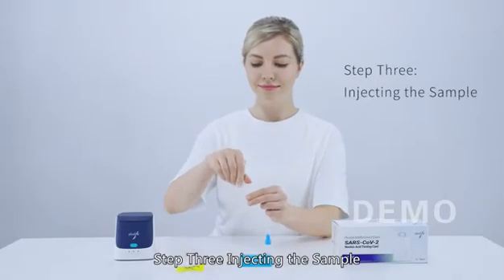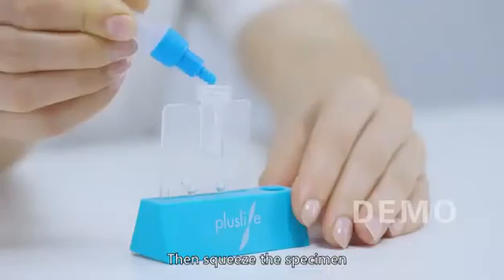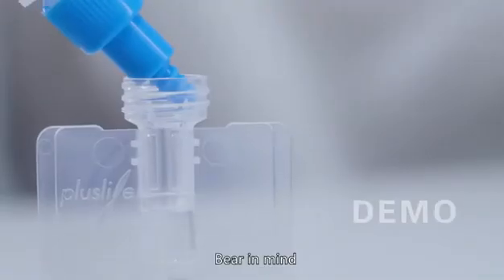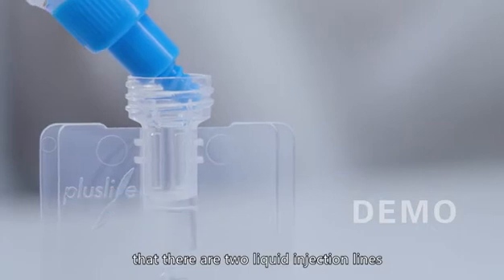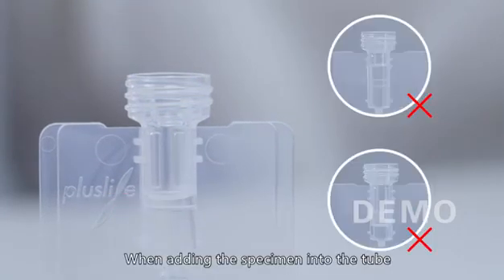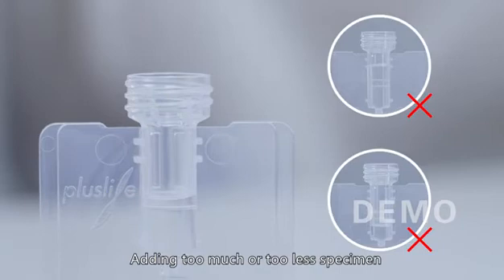Step 3 - Injecting the Sample: Unscrew the cap above the reaction card, then squeeze the specimen into the sample tube of the card. Bear in mind that there are two liquid injection lines marked on the sample tube. When adding the specimen, the liquid level should stay between the two lines — adding too much or too little may cause an invalid result.